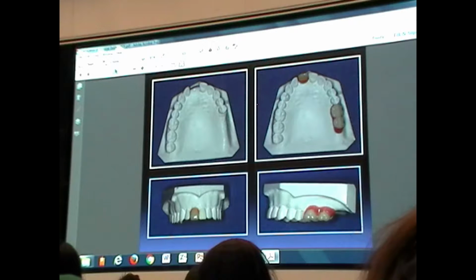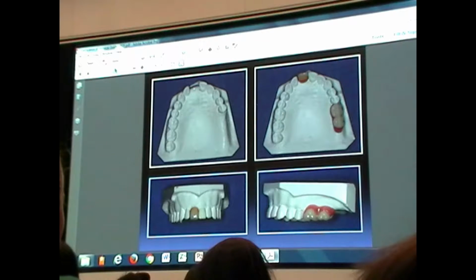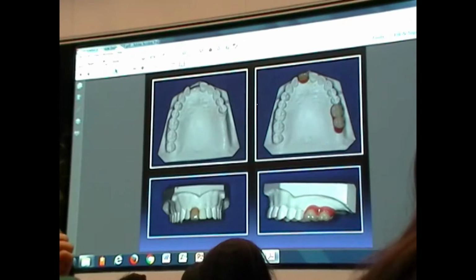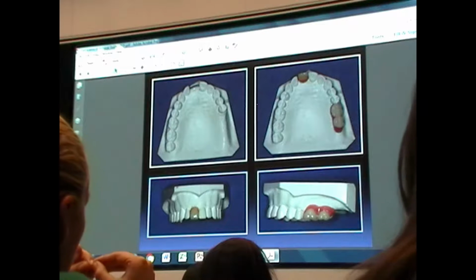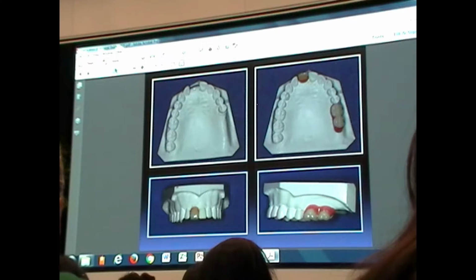You want to make sure that you're able to use stock components versus a custom abutment or custom components. Once the word custom is introduced, that is going to be a cost to you and your patient that you have to discuss early on. And so then that cuts into your overhead and your profit, right? So at all costs, you're not planning to use custom if you don't have to, but it happens.